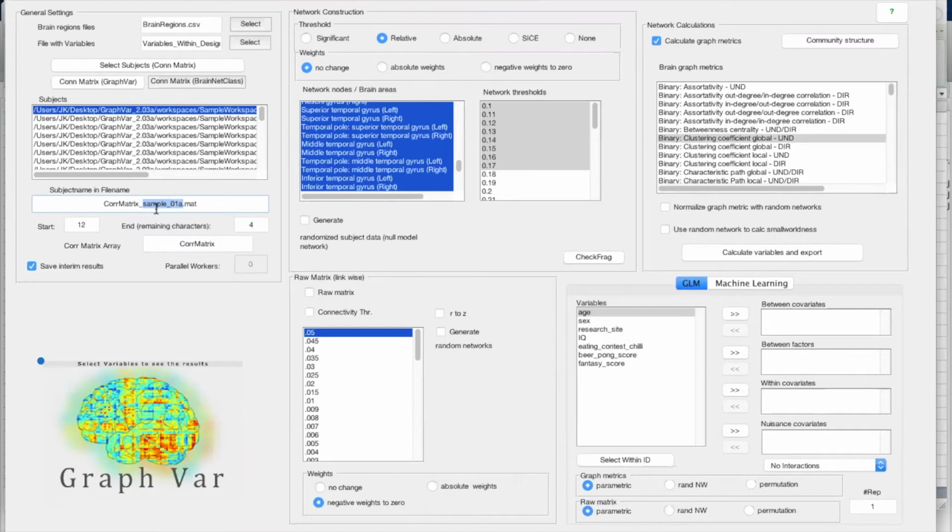So what we'll have to do then, for example, here, is some analysis with thresholding the network, sparsity range from 0.1 to 20% in 1% increases. And now just for the sake of it, we look at the global clustering coefficient and maybe also do some computations on the raw connectivity matrix.